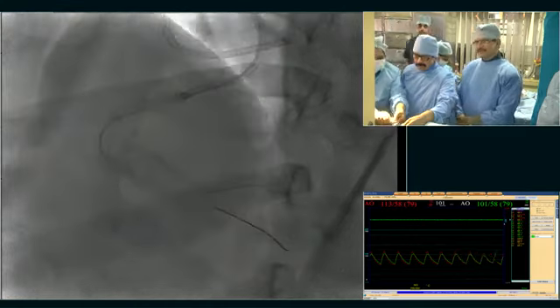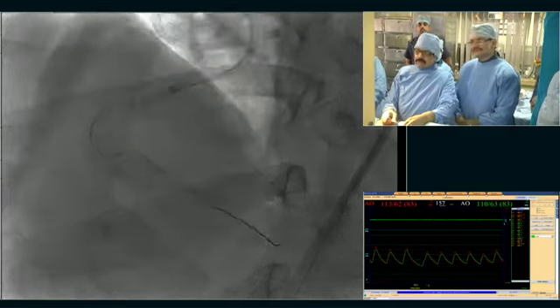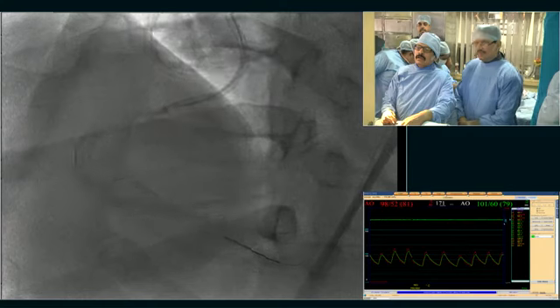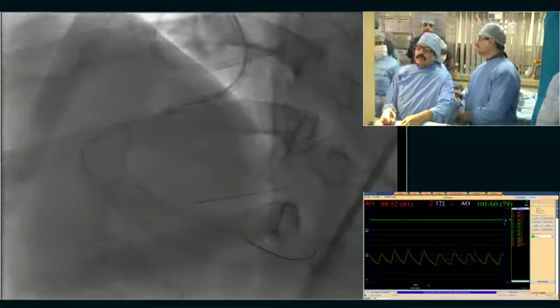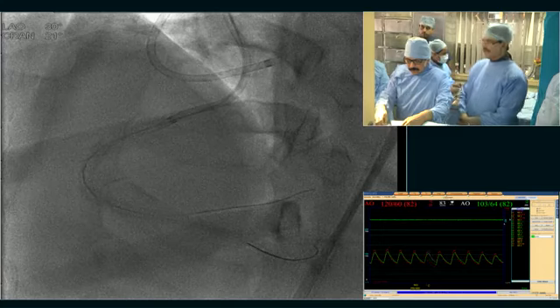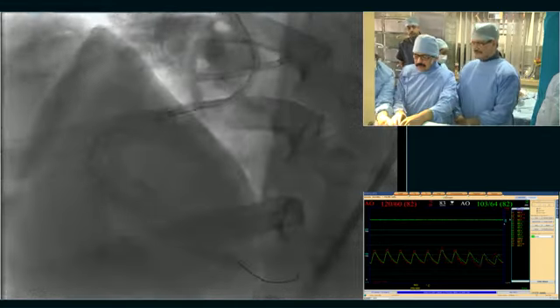First dilate the PLV. So now you plan to use a balloon. Yeah, balloon dilatation for the PLV ostium. Which one? Take a 1.25 balloon. This 1.5 mm balloon. Yes, you can take.